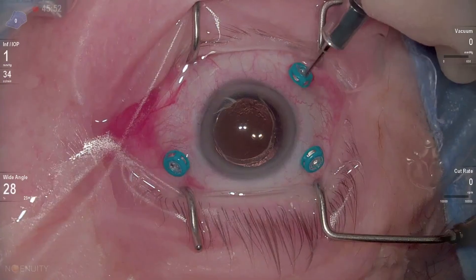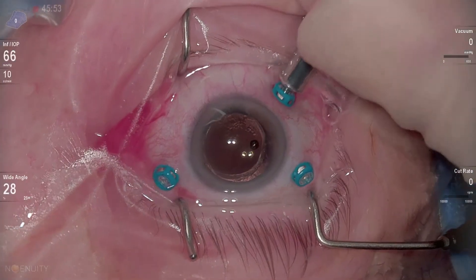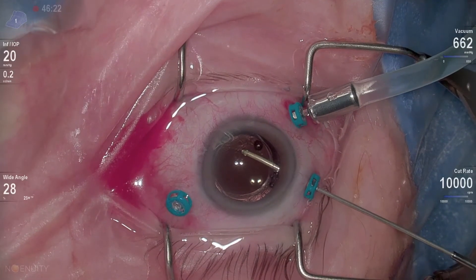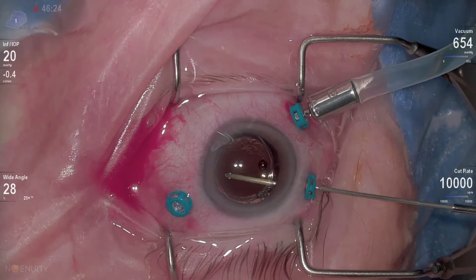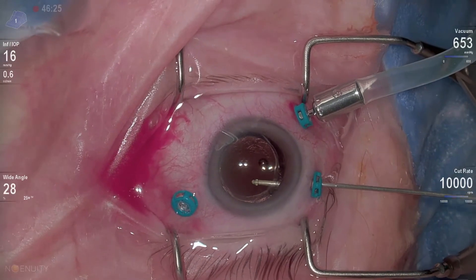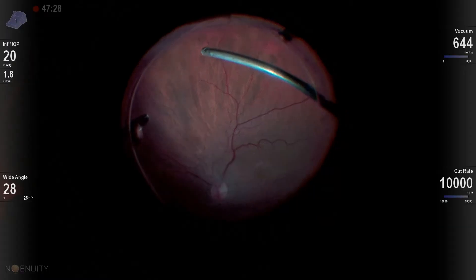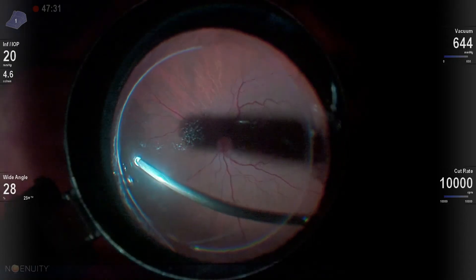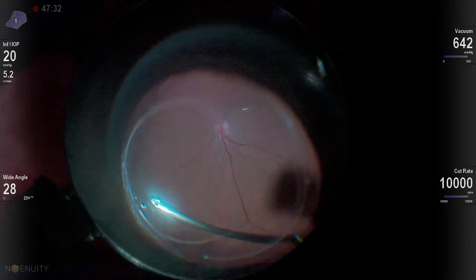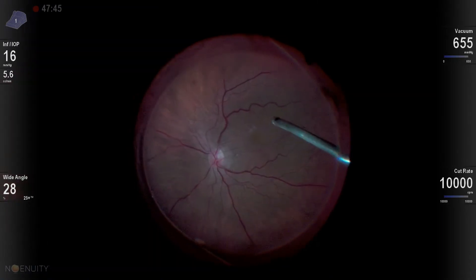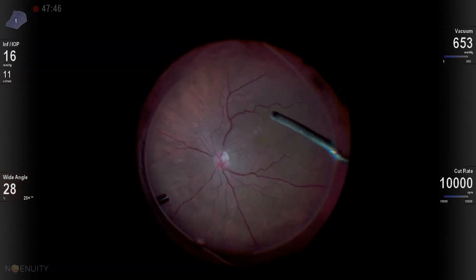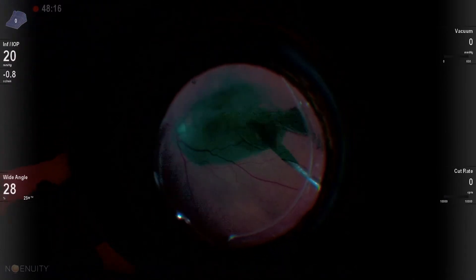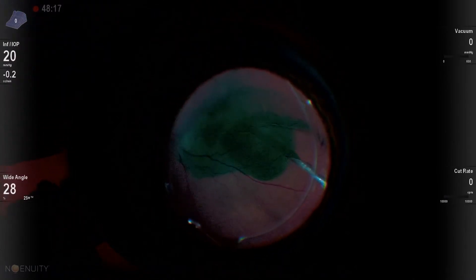One of the most common procedures that we perform is an epiretinal membrane removal, and it's always one of the most rewarding as well. Anytime I'm operating on a pseudophakic patient, I like to be sure and open the posterior capsule. There's nothing worse than clearing floaters out from an eye and having the patient develop floaters after a YAG capsulotomy.